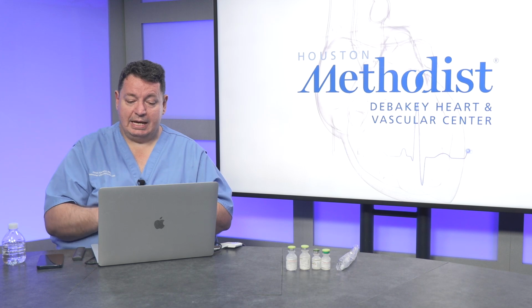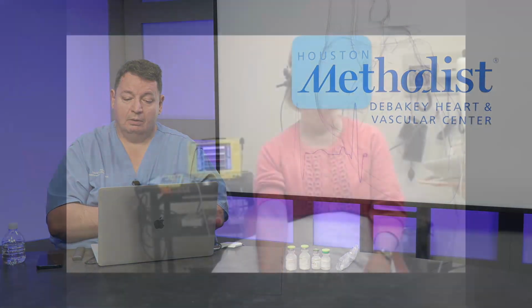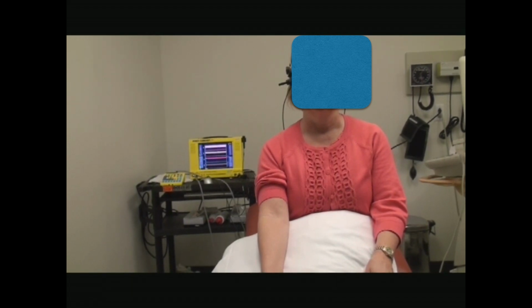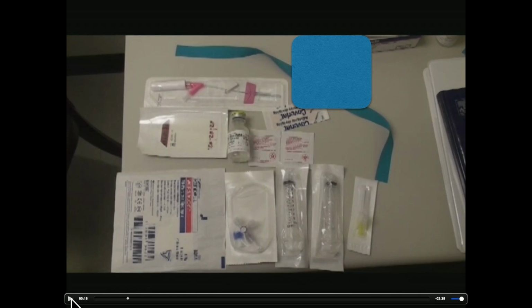I would like to thank my patient who graciously allowed me to videotape this lecture. We are getting ready to start. And the camera was with the husband, so special thanks to my cameraman as well. For a moment, I'm just going to stop here because I want to show you what I'm using. So I have a special Insyte Autoguard Intima butterfly. It's a 20 gauge with a Y configuration, because I can pull out the needle, and with a Y configuration I can connect to my stopcock.